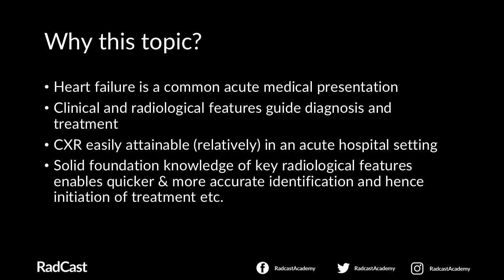But the chest x-ray is, for obvious reasons, a very widely requested investigation when a patient is deteriorating, especially from a respiratory perspective. With, for instance, an increasing respiratory rate, decreasing oxygen saturations, etc. So we can gain a quick insight into what chest pathology might be present to cause the deterioration.